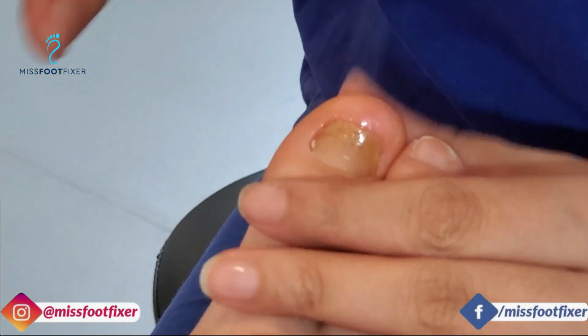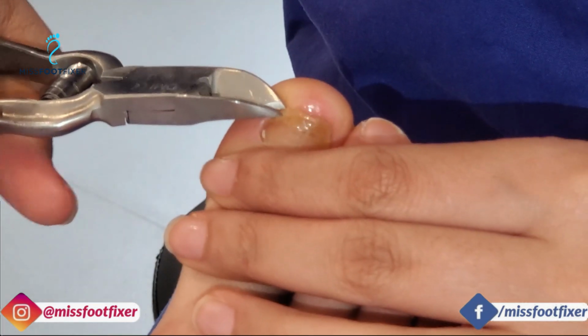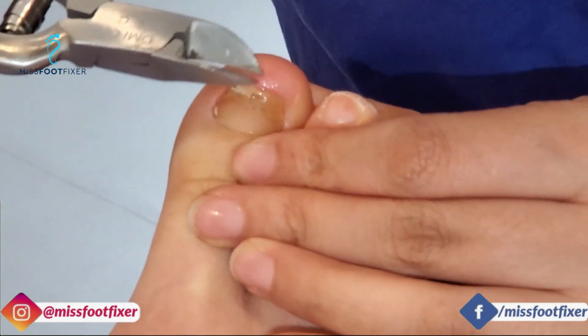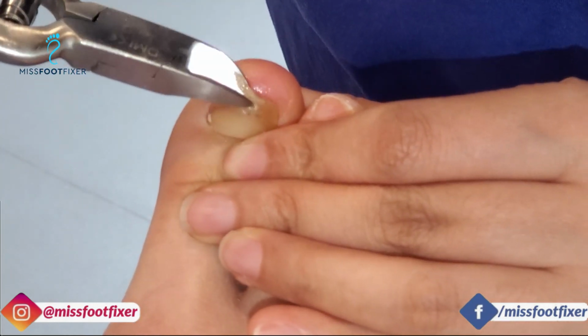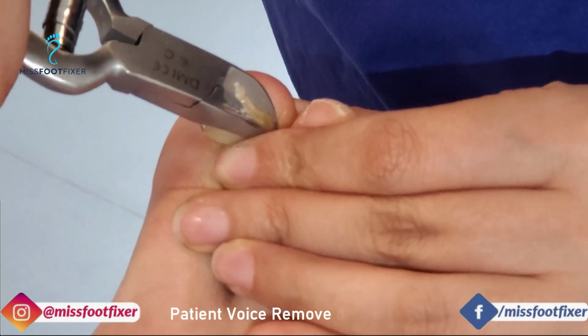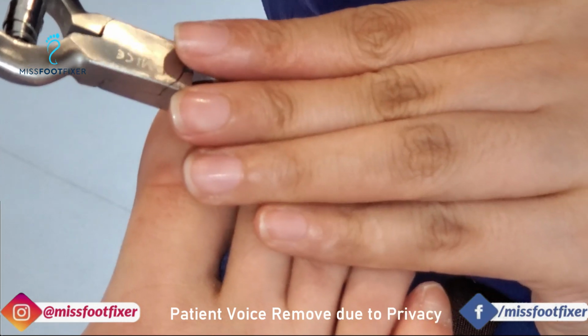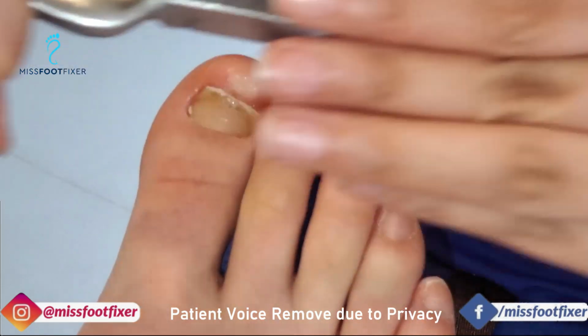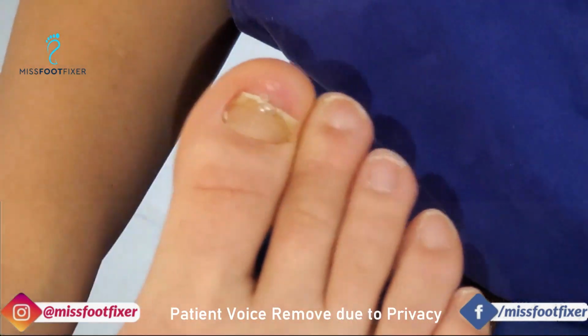Relax for me. Alright, then take off the nails. Is that painful? So what we have to do first is just burr everything down so that it's flattened. Okay?